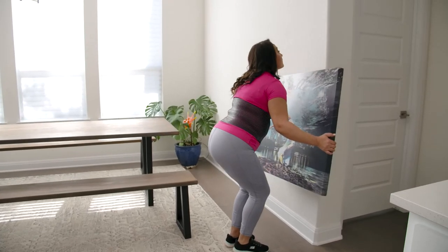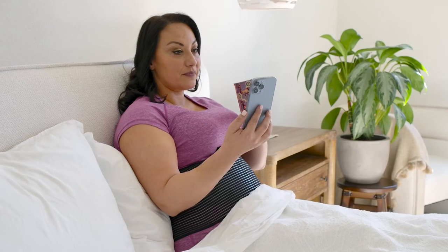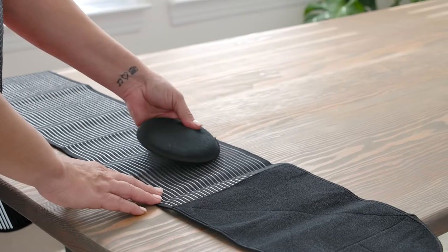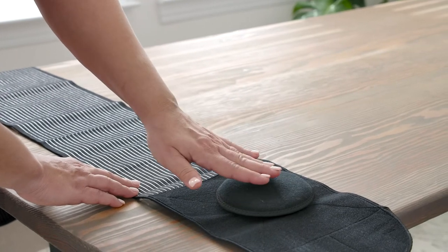The belt is made of breathable materials that provide comfort when performing everyday activities or even just sleeping at night. The included pressure pad can be inserted or removed to best support the abdominal hernia region.